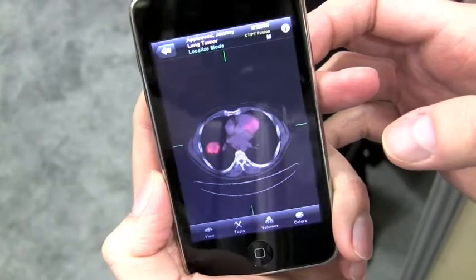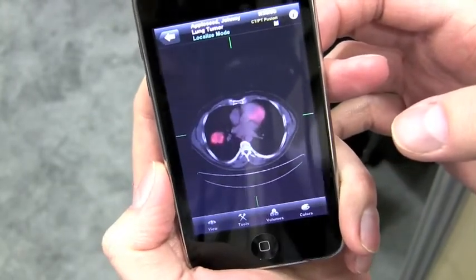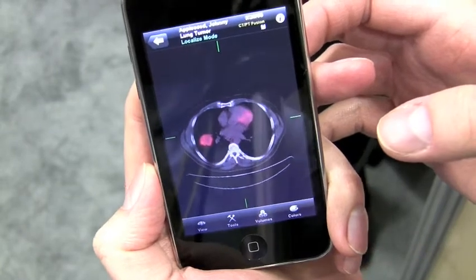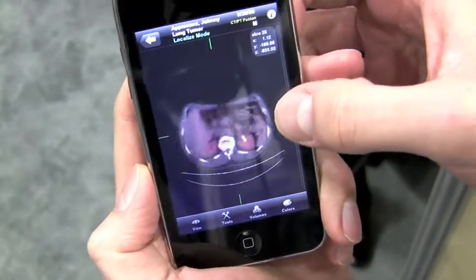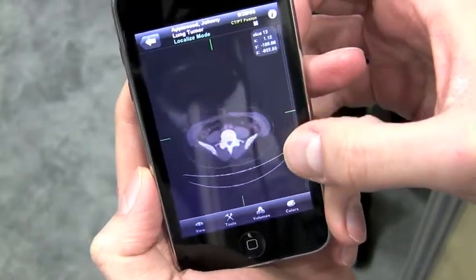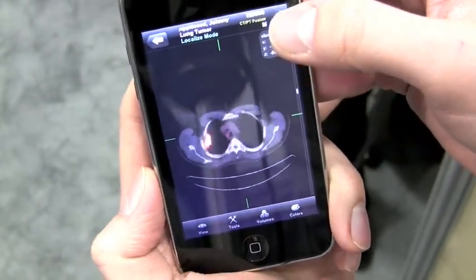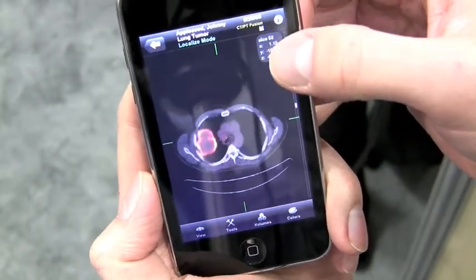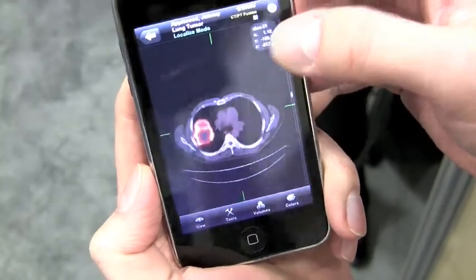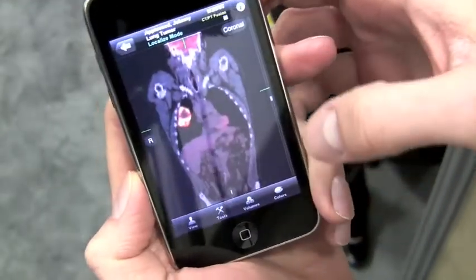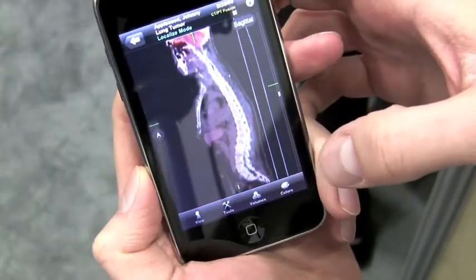Right now you're looking at a fusion of CT as the primary imaging modality and a PET as the secondary. If you move your finger along the right edge, you can move through the slices. This is an axial cut we're looking at. You can see there's a tumor there in the right lung. We can swipe to change planes — this is a coronal view and a sagittal view.